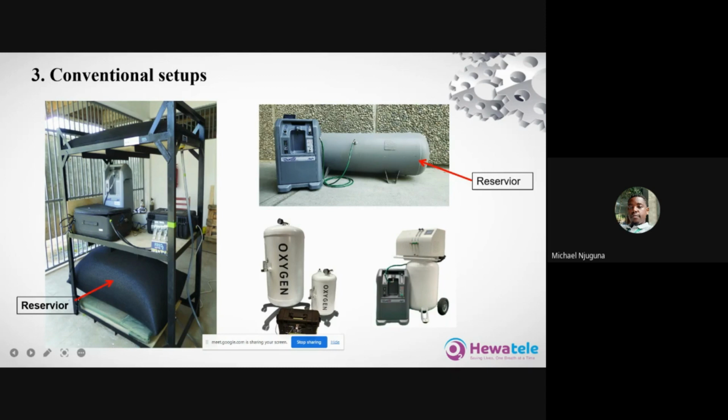So the user feedback on this system is that it is best appreciated by the users, especially in areas where power cuts and power interruptions are prevalent. Especially here in Kenya, I would say the western parts of Kenya, where the weather is very wet, with very many storms and very many episodes of rainy seasons. And in those moments, power cuts and power losses are quite prevalent.